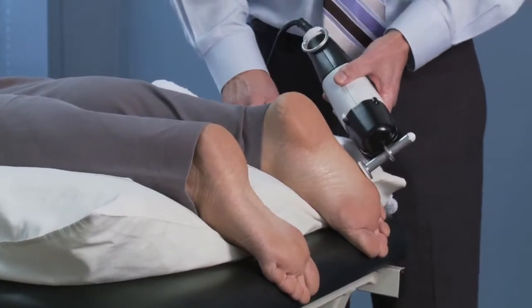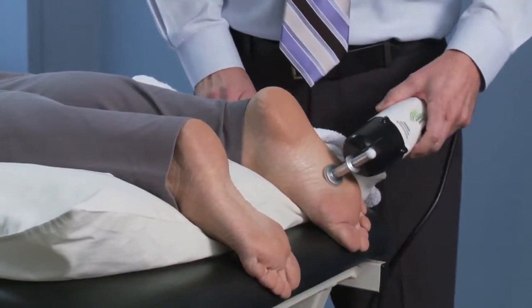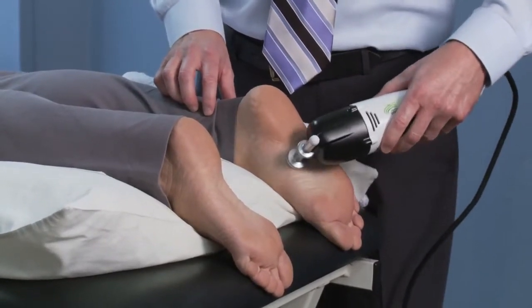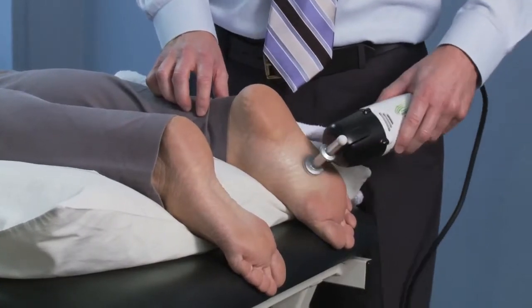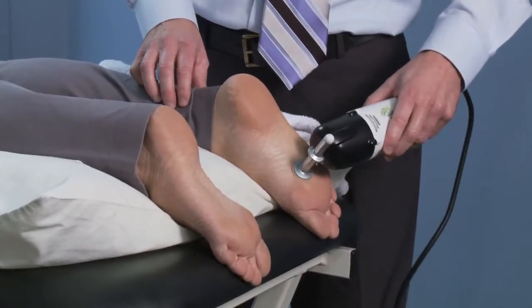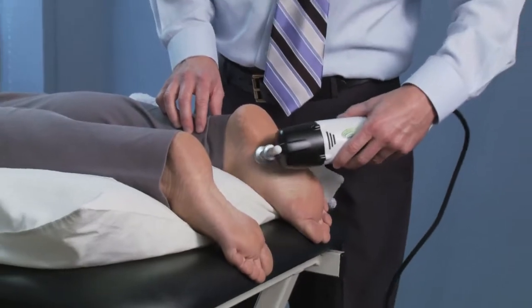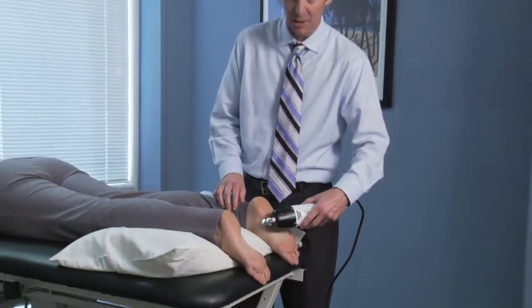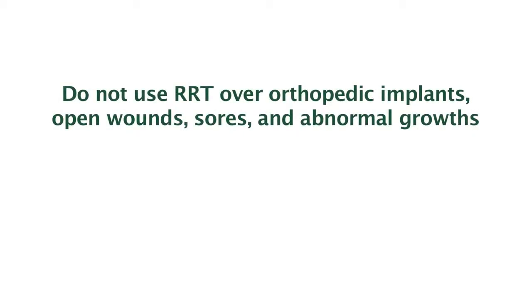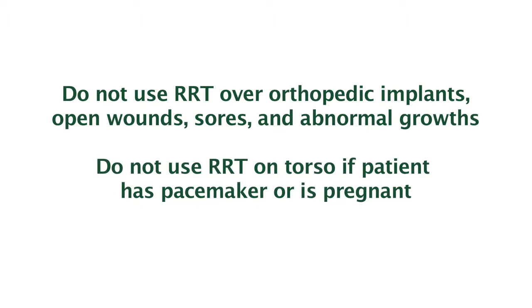I usually start with 30 second increments due to sensitivity and work my way up to about a two minute treatment on the first time. Then I'll wait about five or ten minutes and maybe do an additional one or two minutes maximum, never exceeding four or five minutes on the plantar fascia. That concludes the basic plantar fascia protocol using RRT. Rapid release therapy is intended for relaxing muscles and relieving aches and pain.